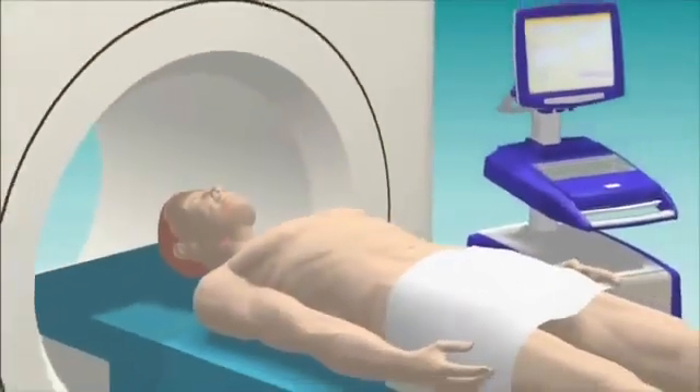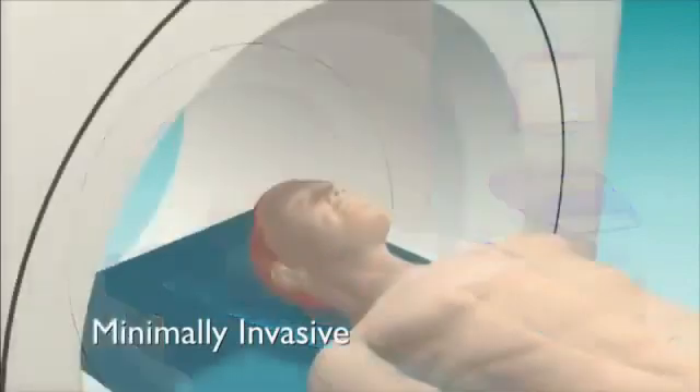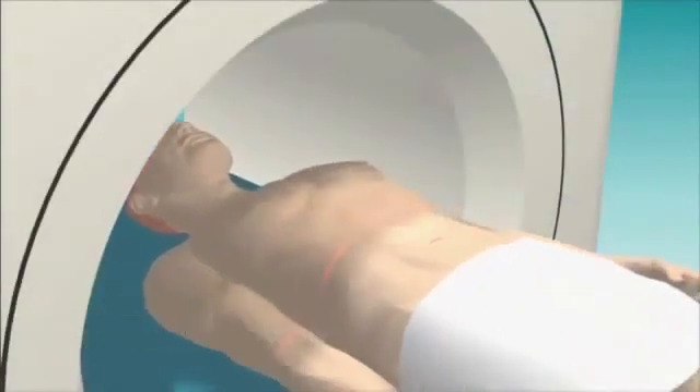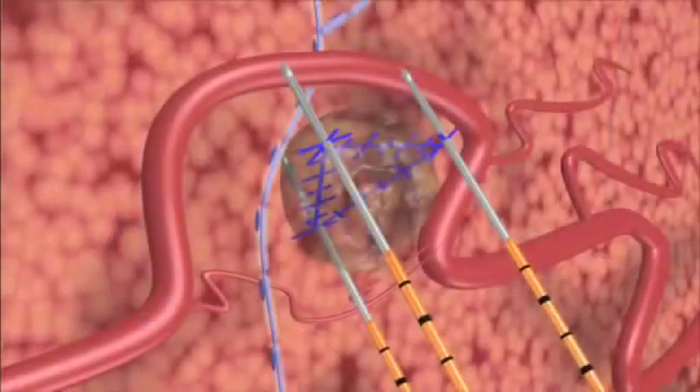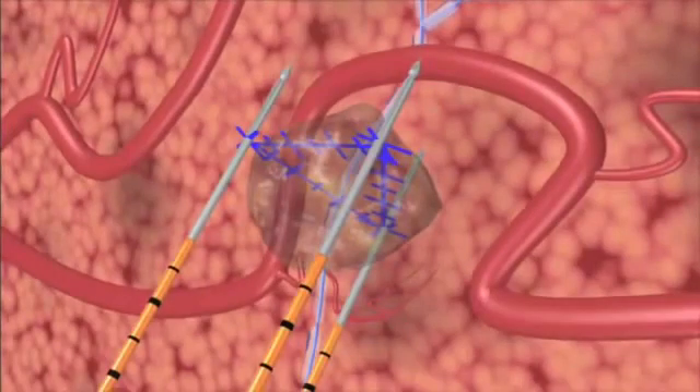NanoKnife IRE treatment is minimally invasive and is performed under general anesthesia with ultrasound or CT guidance. Preoperative imaging allows precise calculation of the tumor volume and shape to be treated and aids the planning of appropriate positioning for the NanoKnife IRE electrodes.